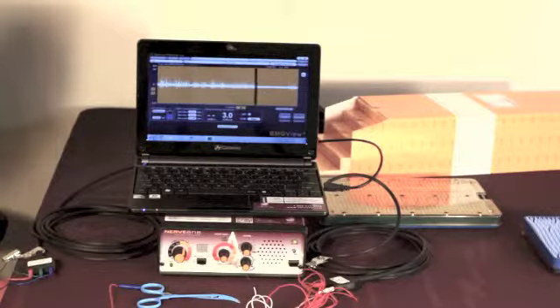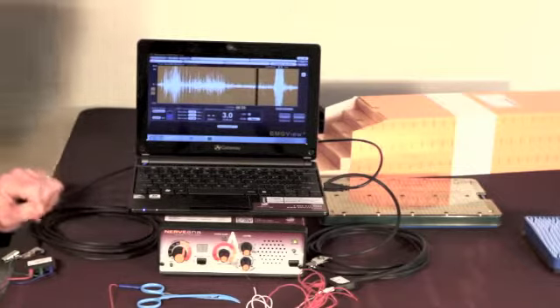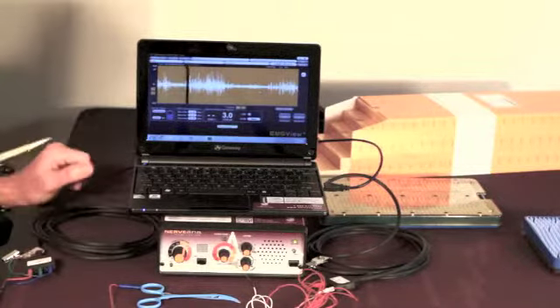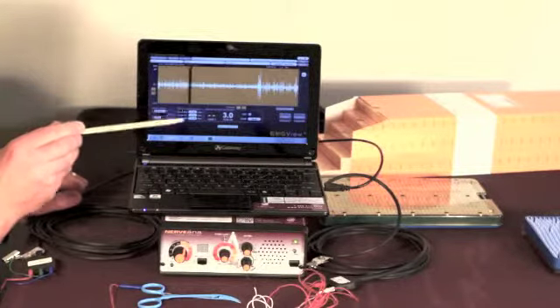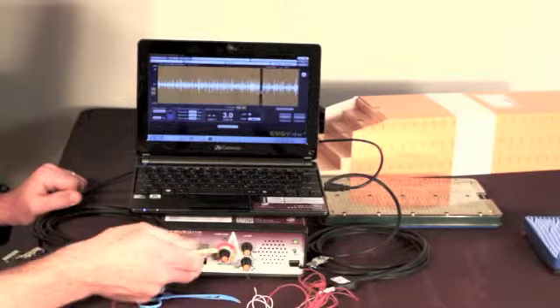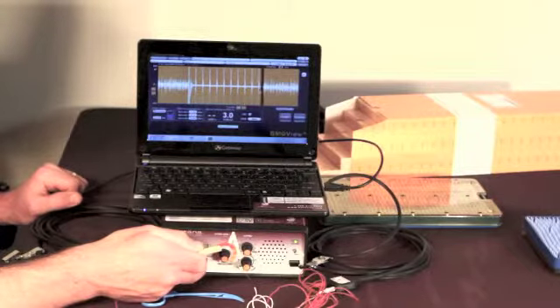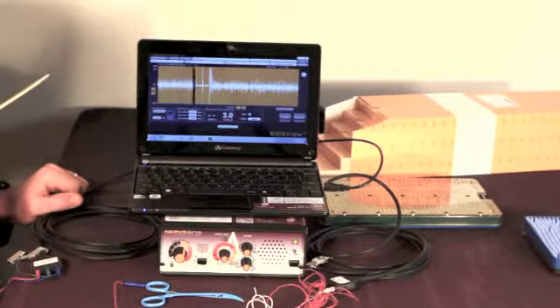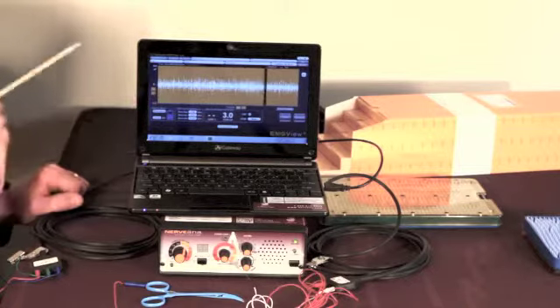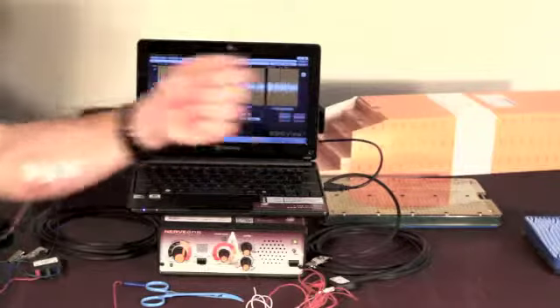And there we go. You can see down here there's a little green graphic spinning that indicates that you are actively recording the case. And right now we have a battery discharging over here on the battery status. We have our impedance readings, which I need to do now just starting the case. So I'm going to go ahead and hold my test button. And those numbers went ahead and updated, and they stay saved on the screen. So I have 7.45, 6.01, and 11.84. Those are all good impedances for hydrogel electrodes.